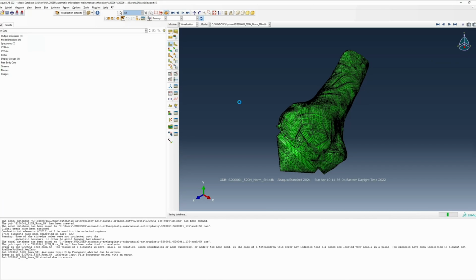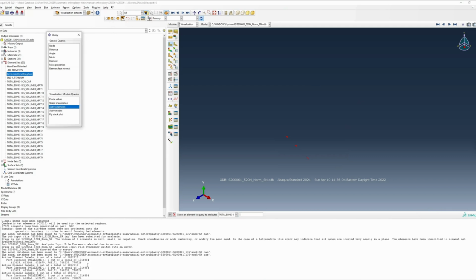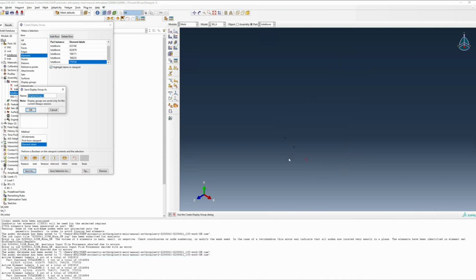As you can see here, my analysis was aborted due to 6 elements having a volume of 0 or negative. I can troubleshoot this by going to my output database and then listing through querying which elements have a volume of 0, and then going back into my model, creating a display group for those elements, and then deleting them in the mesh module.